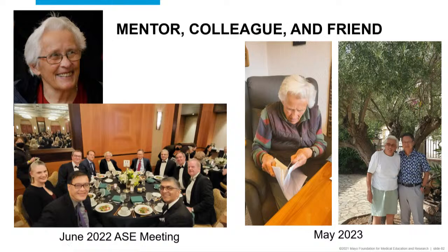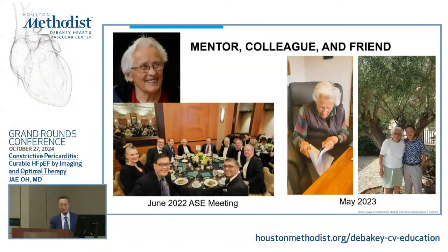Back to your question, I think we did a study. I didn't show you here, but Dr. Miranda did a study of cardiac surgical patients. Soon after surgery, we did echocardiograms on about 200-300 patients, and 20% of them developed transient constriction by Doppler echocardiogram. So echocardiography shows the hemodynamics of constriction 1 or 2 or 3 days after the cardiac surgical procedure. So we do Doppler echocardiograms for constriction on all of them.